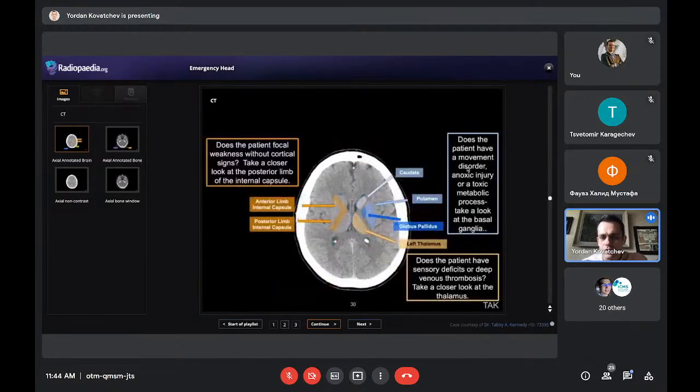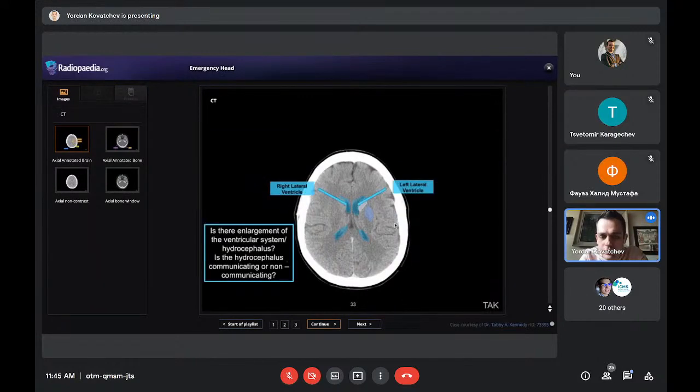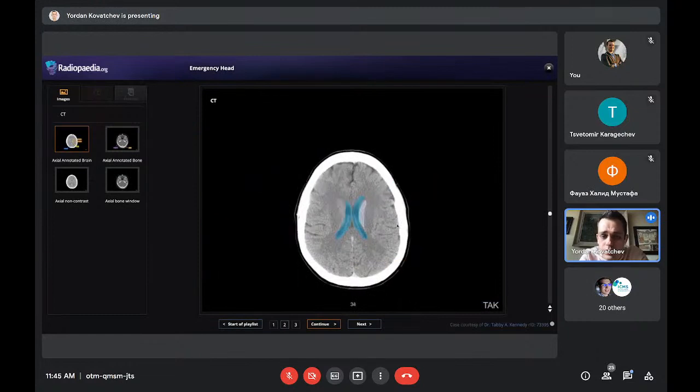It's also important, as they say here, to understand this anatomy, because often the clinical presentation, that's why it's really important to us to know what's going on with the patient. We can correlate it to different parts of the brain. So you need to understand where everything is and how it's connected. I'll show you now with the cases. It's really interesting, actually, most of the times.